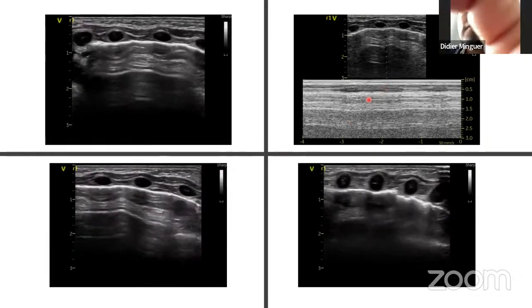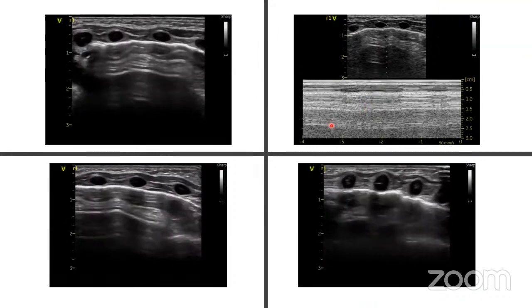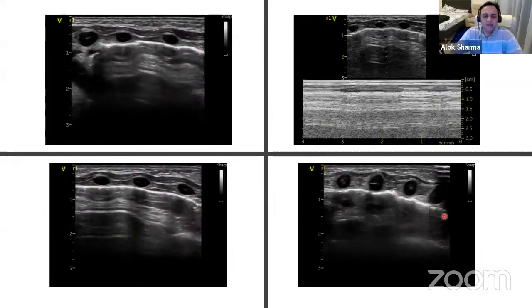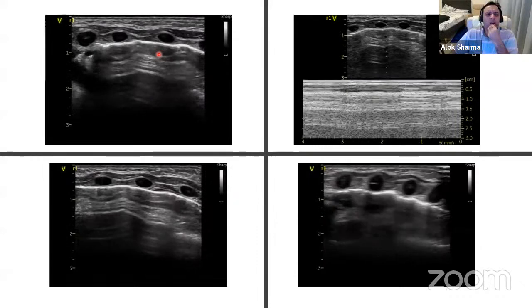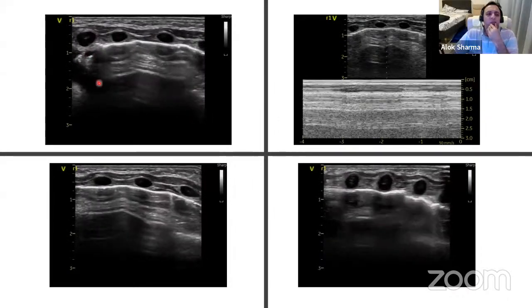M mode? M mode, yes. Okay, so what do we think about the M mode? Alok, in the leftmost part of this image, the pleura seems to have broken. Over here? Yes. Okay, I want you to forget these images. Forget the lower images. We'll talk about the lower images, the mid-zone, later. No, I'm not talking about the lower images. This is the same R1 top image. At the left extreme. Yeah. There are subpleural consolidations. Yeah, you're right. There might be a small consolidation over there.